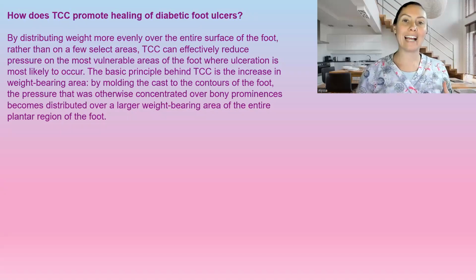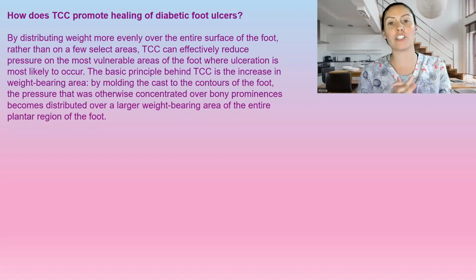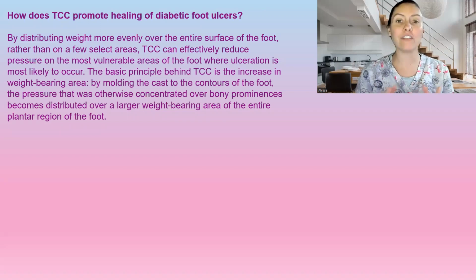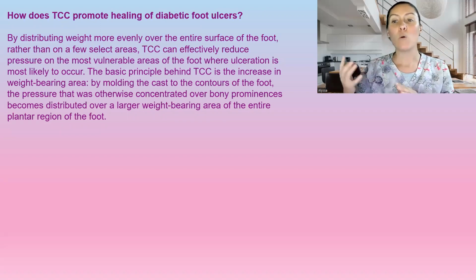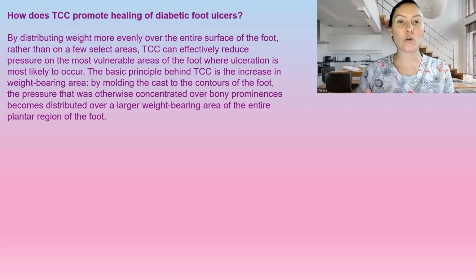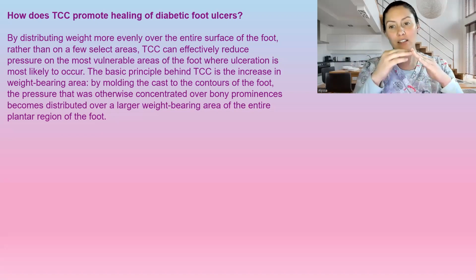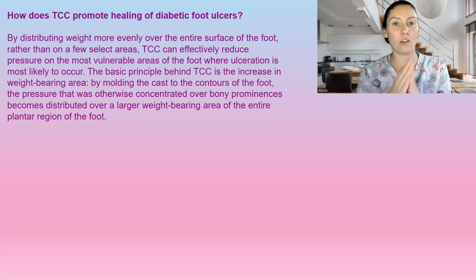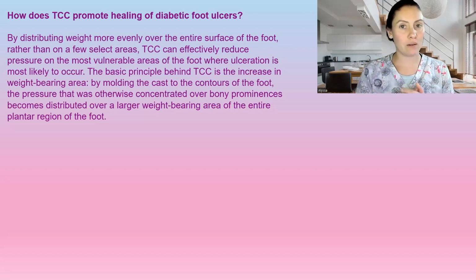So how does total contact casting promote healing of diabetic foot ulcers? It distributes weight more evenly over the entire surface of the foot rather than a few select areas. Total contact casting can effectively reduce pressure on the most vulnerable areas of the foot where ulceration is most likely to occur. The basic principle behind total contact casting is increasing the weight-bearing area by molding the cast to the contours of the foot. The pressure will otherwise concentrate over bony prominences. So it evenly distributes the weight over a larger area, the entire plantar region of the foot. Okay, so we're distributing the weight so it's not concentrated in one area where you're getting a pressure ulcer.